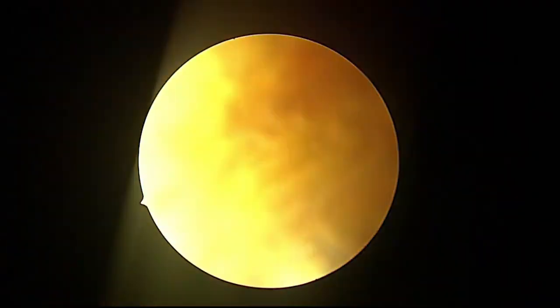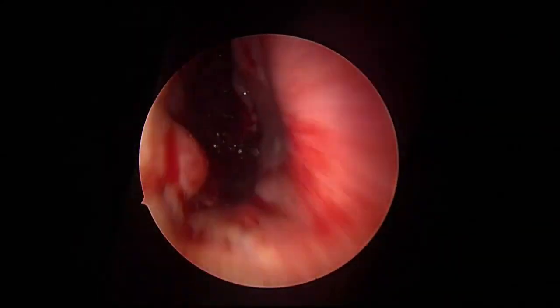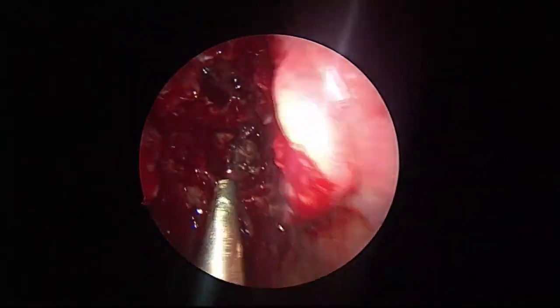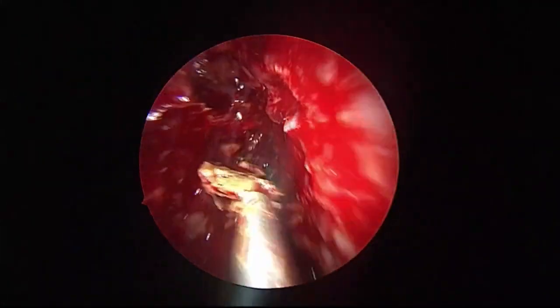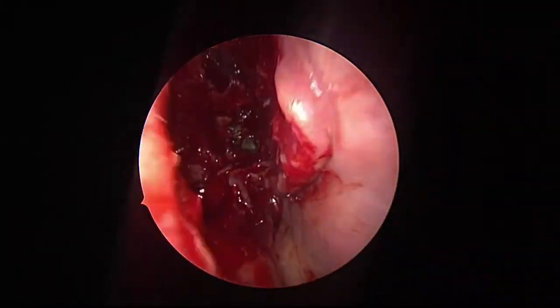See what a tool. Already the roof is eroded. Pardon? The sphenoid roof is eroded. Yes, the sphenoid is eroded from many places.